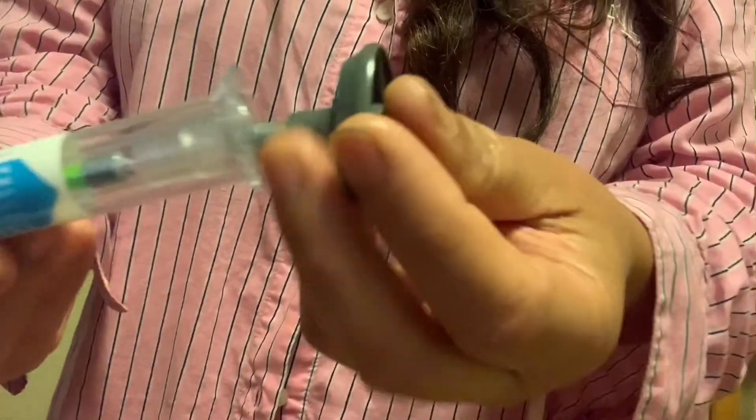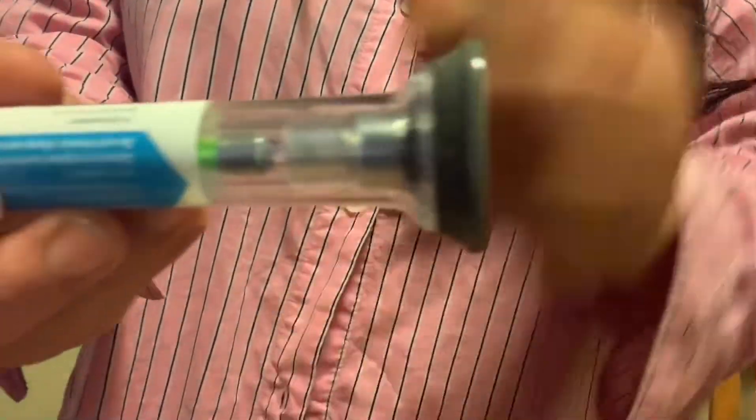This is what the needle looks like after — I put the cap back on and it's ready to throw away.